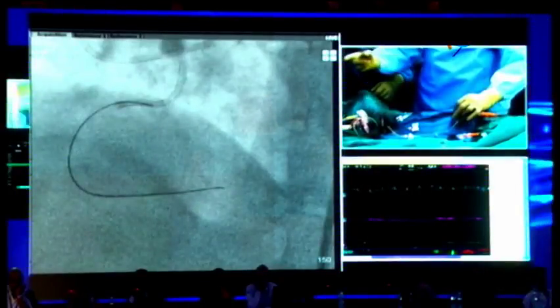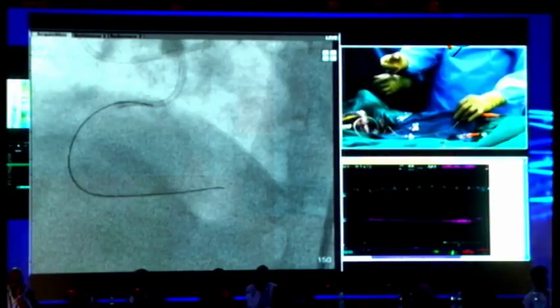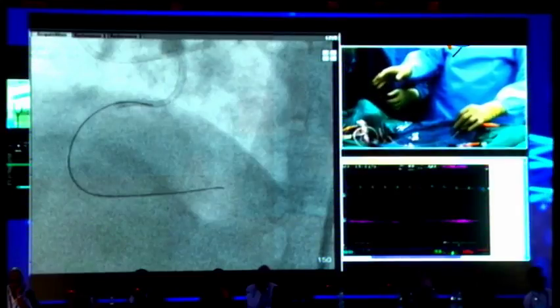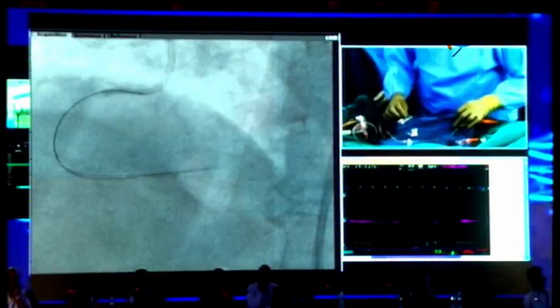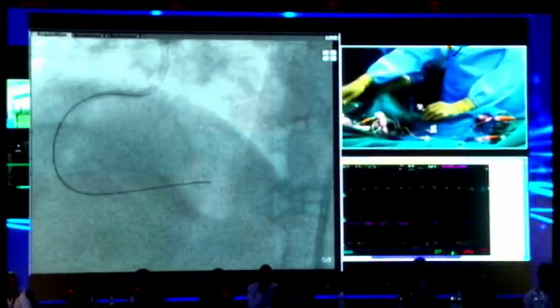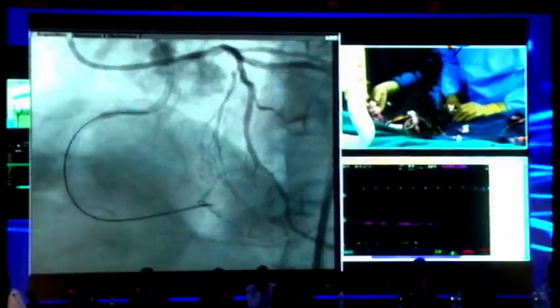Something is leaking from there. What's that? Okay. It's okay now? Now okay? All right, good. All right. But how do you understand the position? Retrograde injection, please. With a retrograde shot, inject. Okay. Okay.